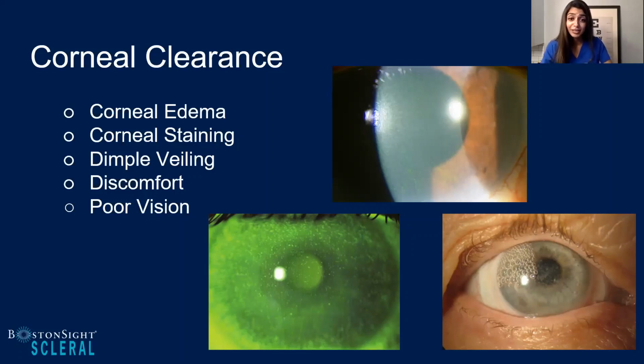Discomfort, this is a great one when you're thinking about scleral lens and bubbles in that tear meniscus, because oftentimes we've all had patients that will come in for their scleral lens follow-up, and you pull that slit-lamp around and they're complaining about the comfort or their vision, and there it is, a big bubble. So really identifying those bubbles, teaching and educating your patients, but also taking the lens off and staining and looking at how that's implicated your cornea.